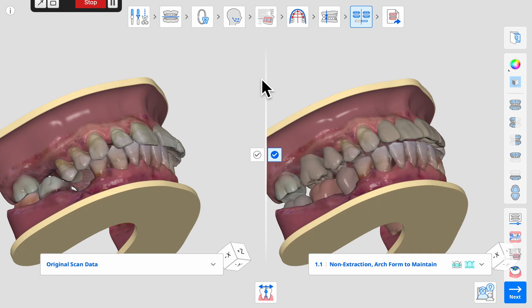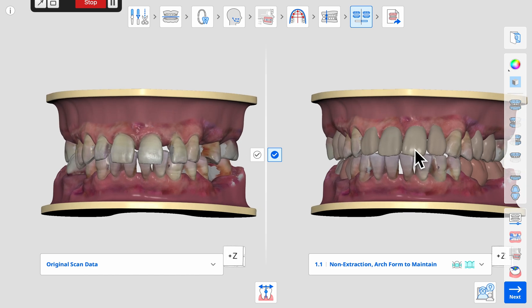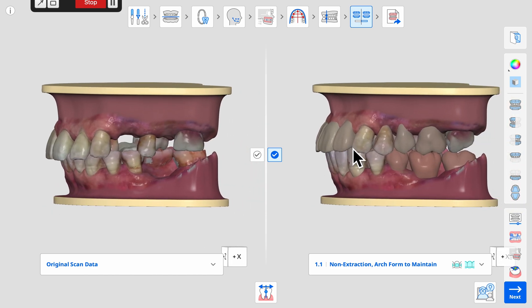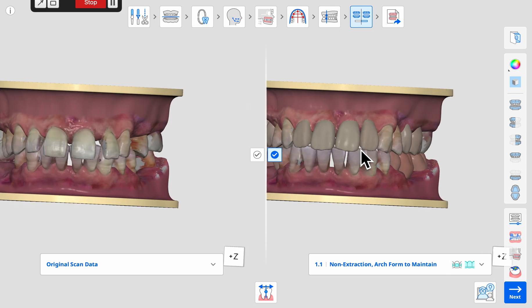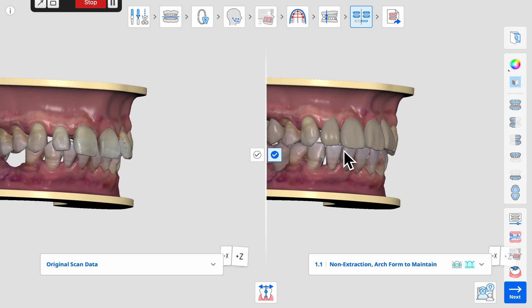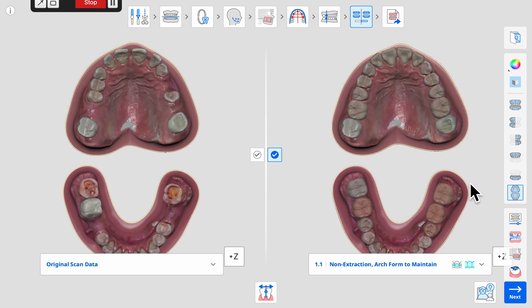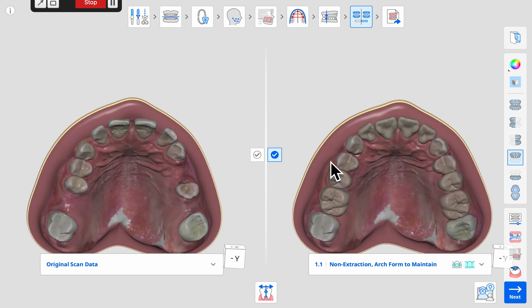Missing and severely worn teeth that were previously identified as planned restorations are automatically replaced in the simulations. The simulation is like a digital wax-up representing both the proposed orthodontic treatment as well as the approximate size, shape, and location of the planned prosthetic restorations.